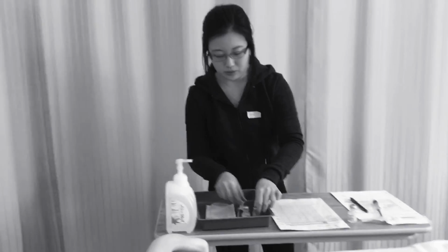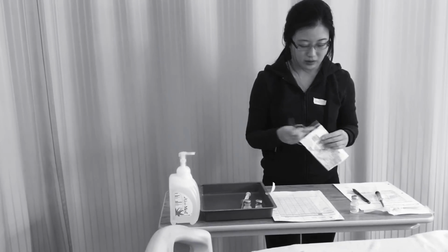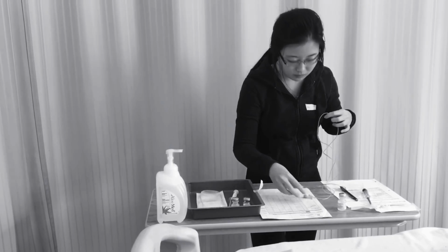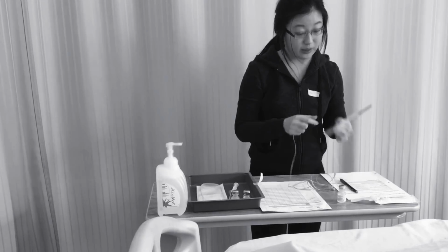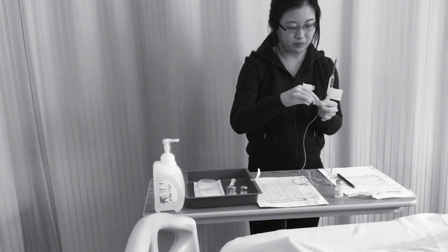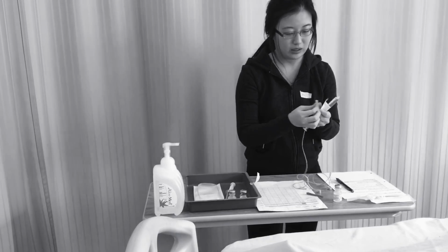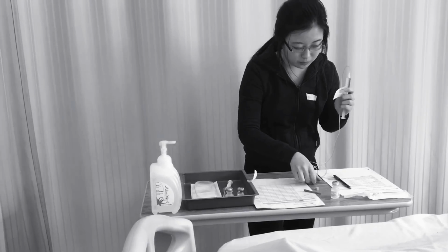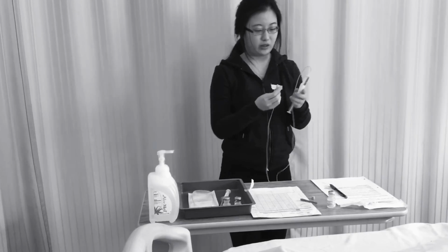And now I need to prime the tubing. So I'm just going to pull back on here so we don't lose anything. And then I'm going to uncap this, uncap this, connect it. And I'm just going to prime the tubing, so I'm just going to see that it comes out the other end.